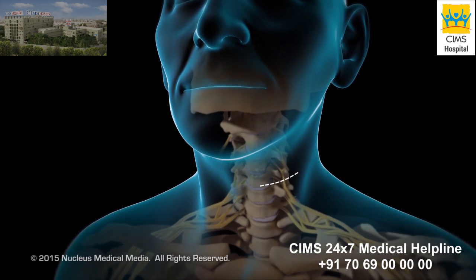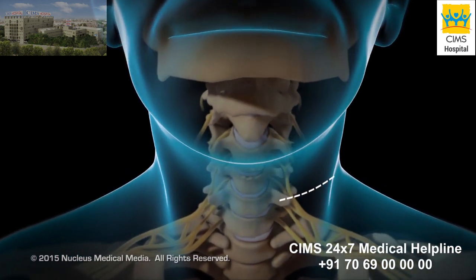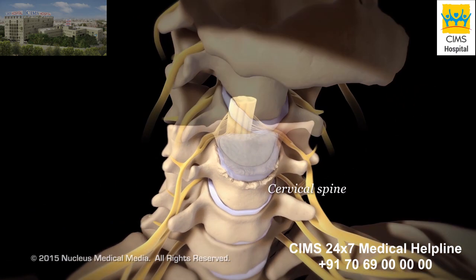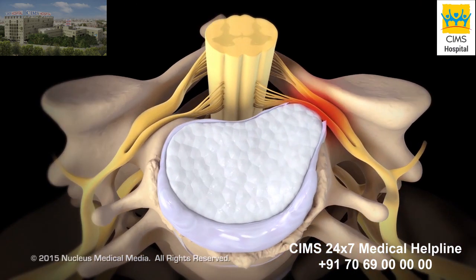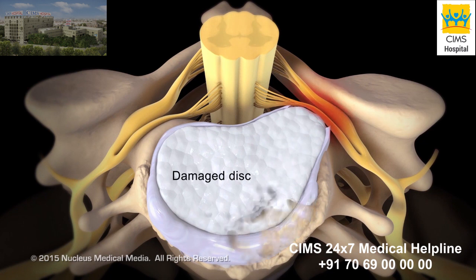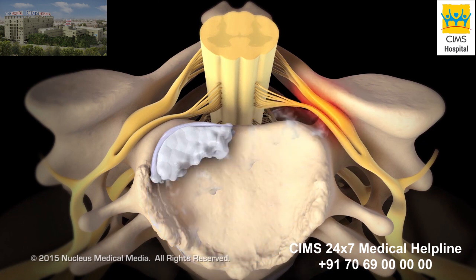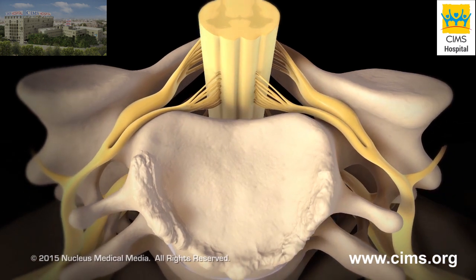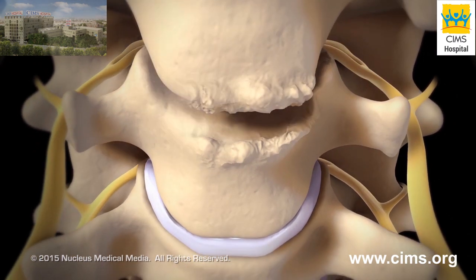Your surgeon will make an incision on your neck. The front of your cervical spine containing the damaged disc will be exposed. Your surgeon will remove the entire damaged disc, which helps relieve the pressure on your spinal cord and nerve roots. Then your surgeon will remove any bone spurs.